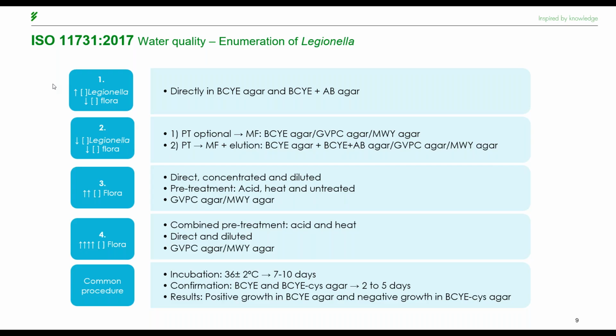We have a sample with a low concentration of Legionella and also a low concentration of accompanying microorganisms. We can approach this two ways.